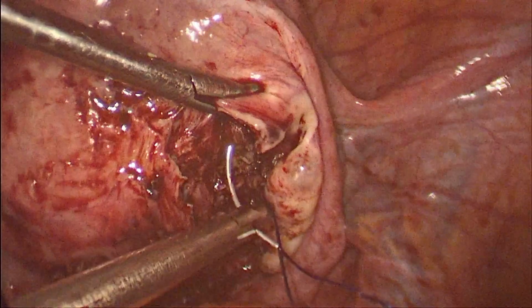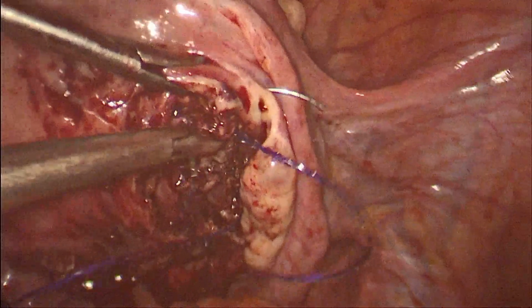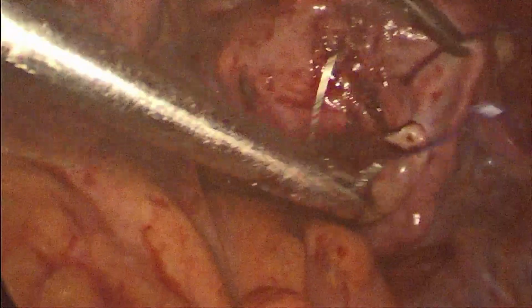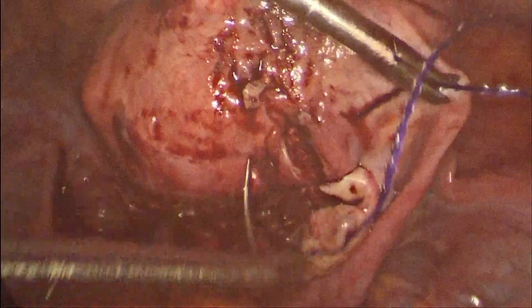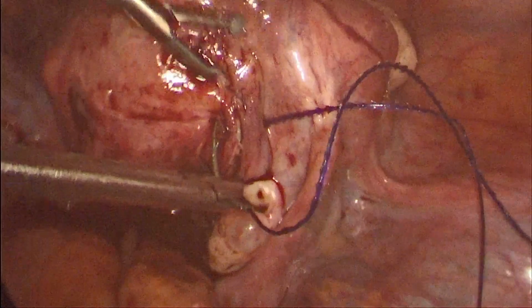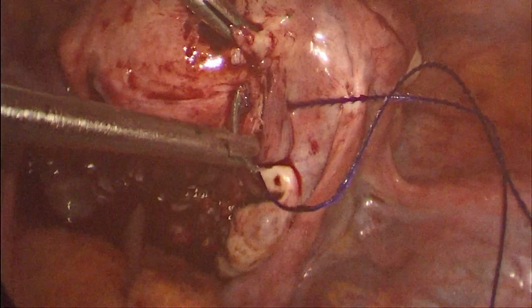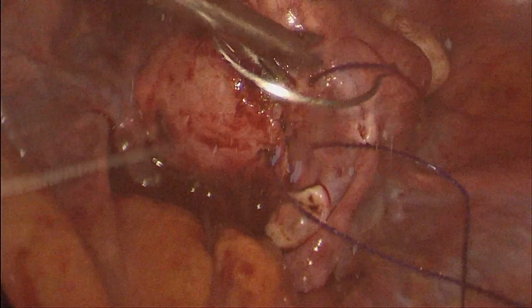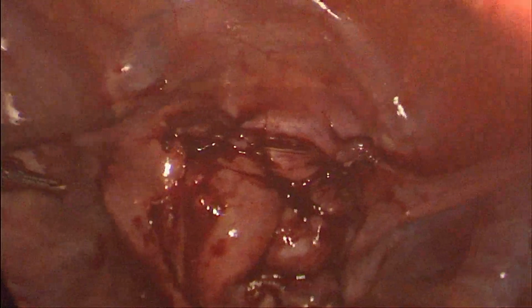So with this we come almost to the end of suturing of this incision, which gives a normal shape to the uterus, and uniform hemostasis is achieved.